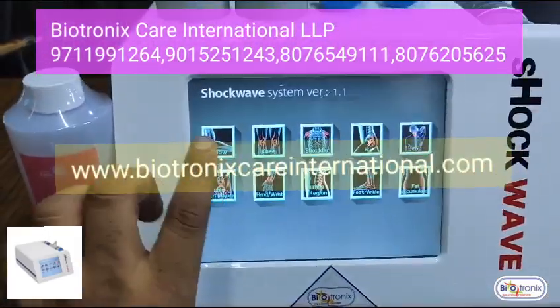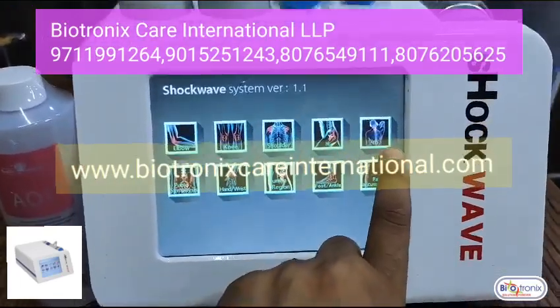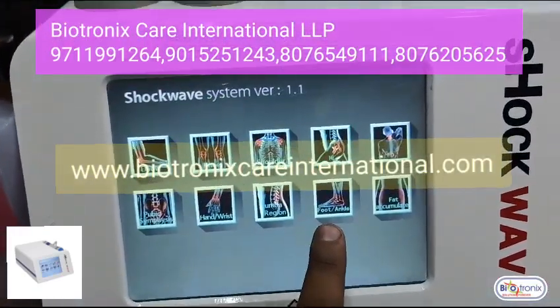Let me show you how to operate it. You can select any module: elbow, knee, shoulder, hip, ED, hand, lower back, lumbago, and foot.